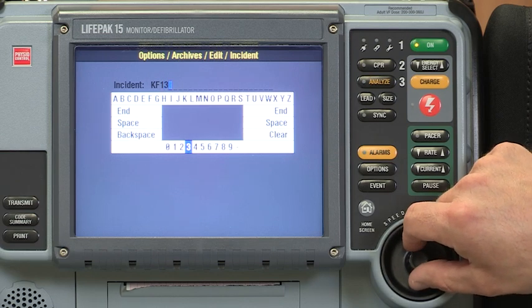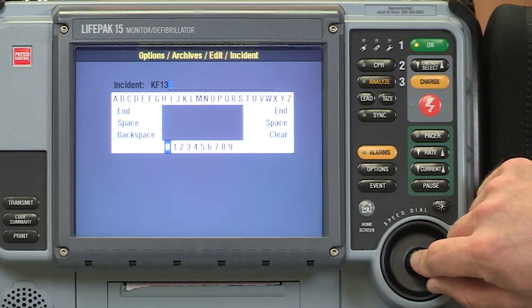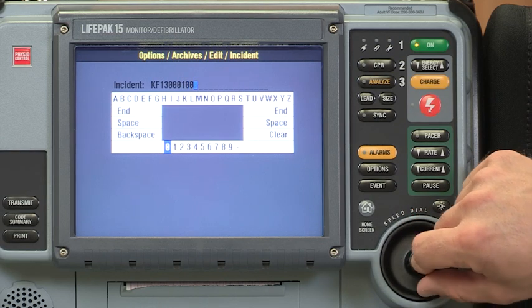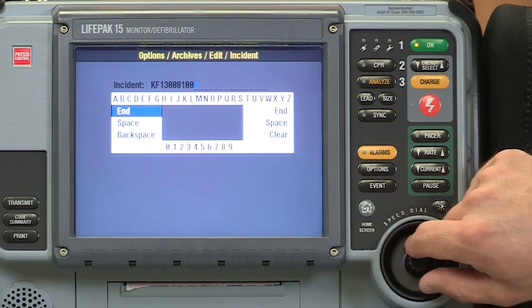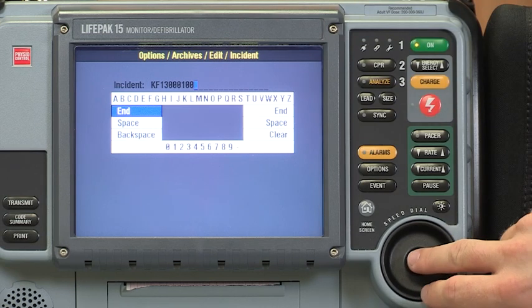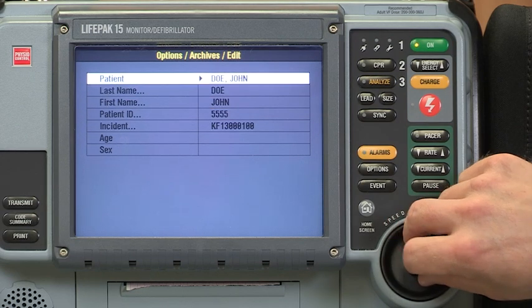And then we need 6 digits following the year. So we'll just type in, say this was event 100 for us. So again, to be sure you have the six digits, you'll have to put zeros in front of your incident number to allow for the full 6 digits following the year. Select End. Then you've got patient age and sex.